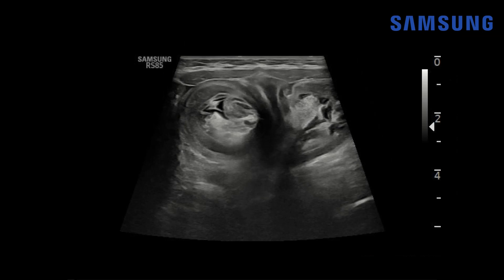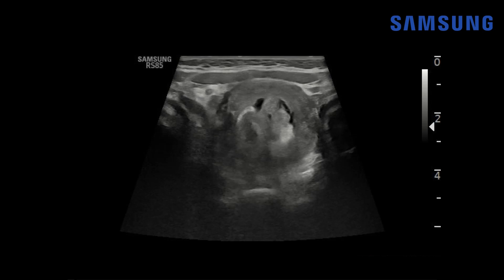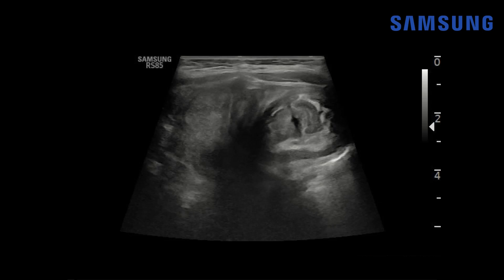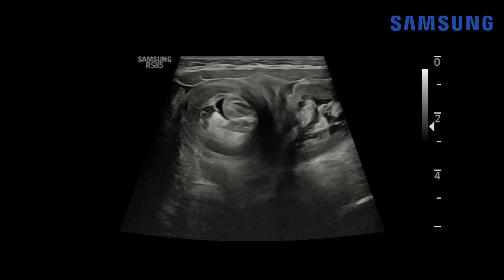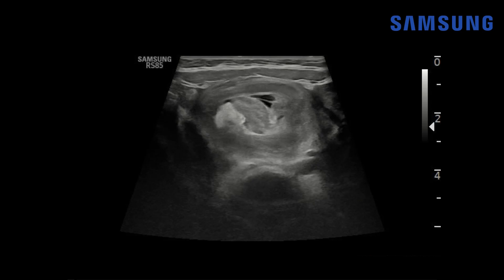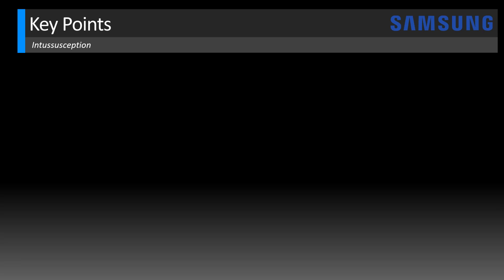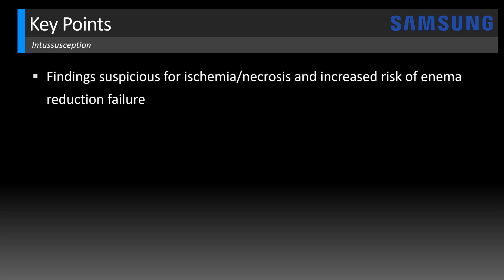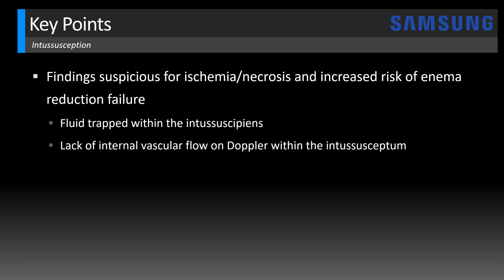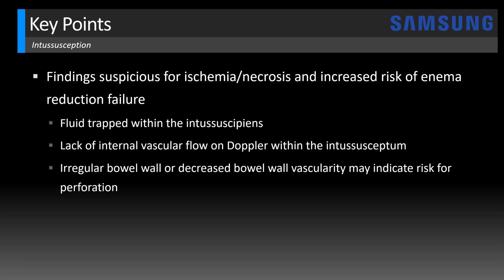On real-time imaging we see just how complex this intussusception is — the prolapsed loop is rather long with a tethered appearance. This was not able to be successfully reduced with air enema and went to surgery, where the bowel was found to be necrotic and needed to be resected. Findings that raise suspicion for ischemia or necrosis and increased risk of enema reduction failure include: fluid trapped within the intussuscipiens, lack of internal vascular flow on color Doppler within the intussusceptum, and irregular bowel wall or decreased vascularity indicating friability and increased perforation risk. If any of these findings are present, it's important to alert the team that surgery needs to be on standby.